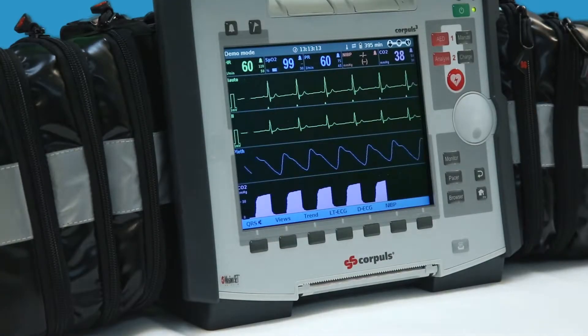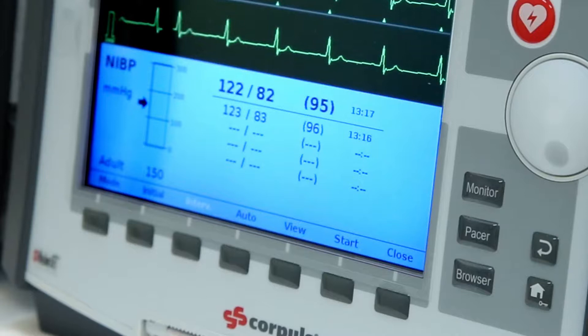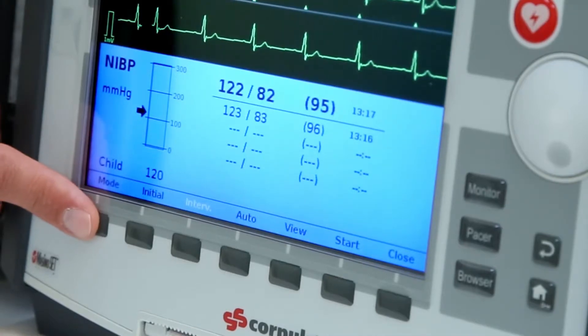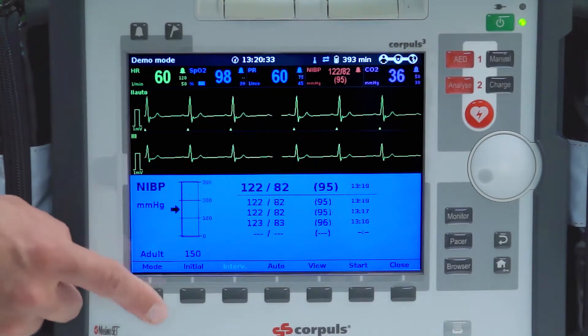To take an NIBP measurement on a CORPALS 3, press the NIBP button on the bottom of the screen when in monitoring mode. Before taking a reading, choose between adult, children, and neonatal mode by pressing the soft key displaying mode in the bottom left corner of the screen.